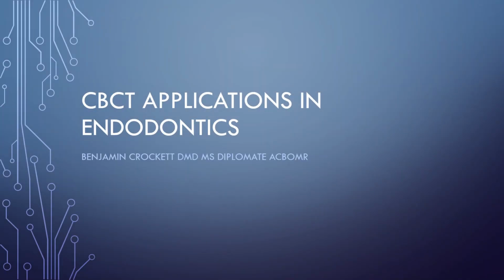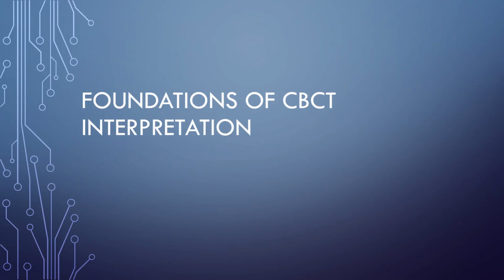CBCT, Applications in Endodontics. Foundations of CBCT Interpretation.